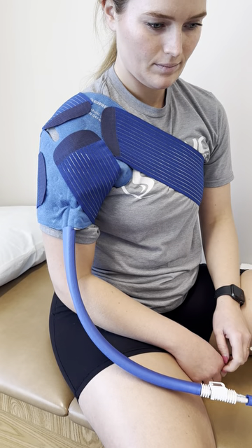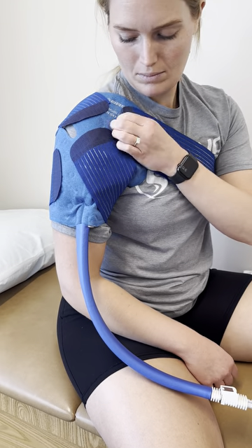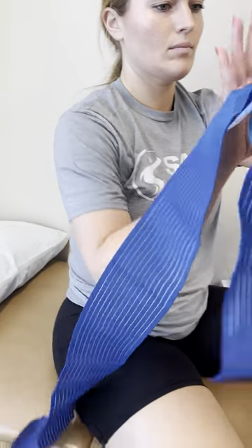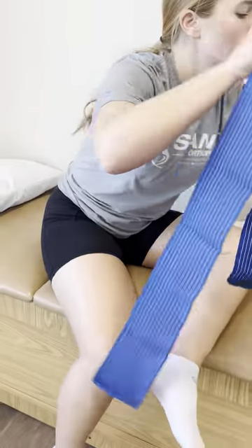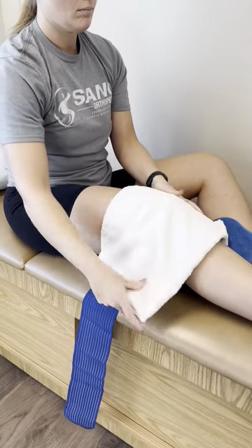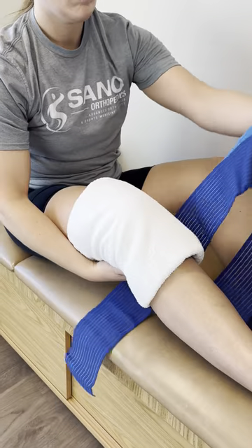This pad that we carry in our office is a universal pad, so it can be used on multiple joints — one being the shoulder and two being the knee. Make sure that when switching the pad, you still use a thin layer between the pad and the skin.